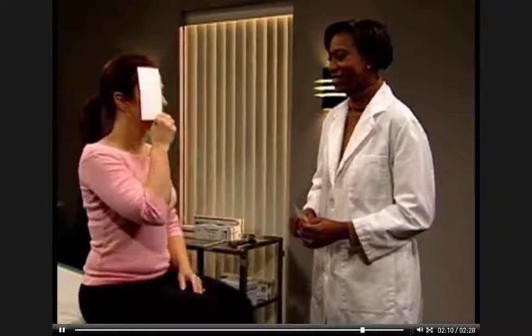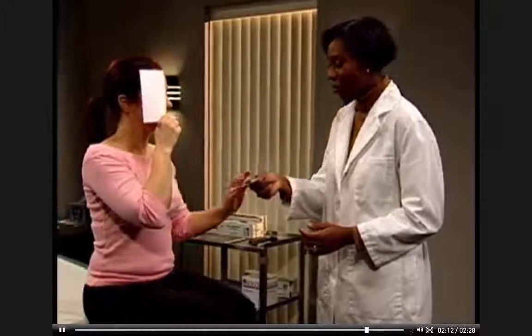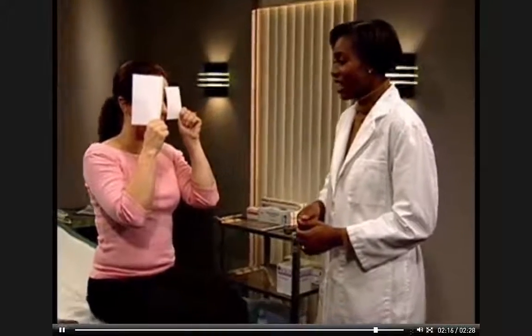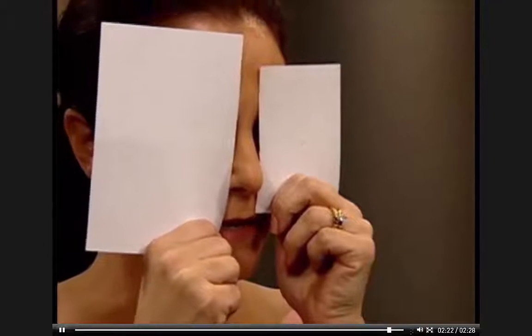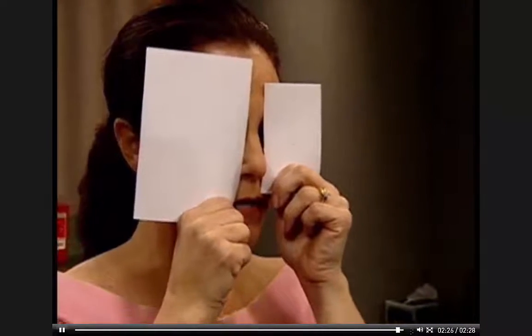Now cover your right eye. If the patient's distance vision is less than 20/20, have her hold a card with a small pinhole over the uncovered eye and read the chart again. If visual acuity was reduced by a refractive error, this should improve acuity by at least one line. T-E-C.